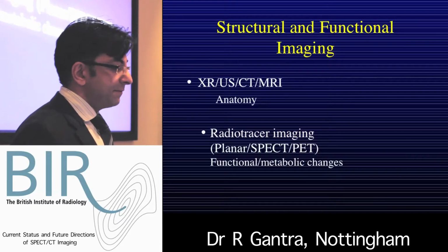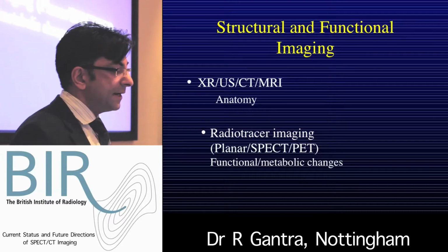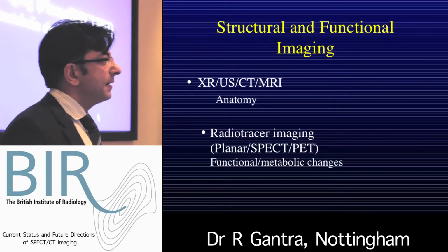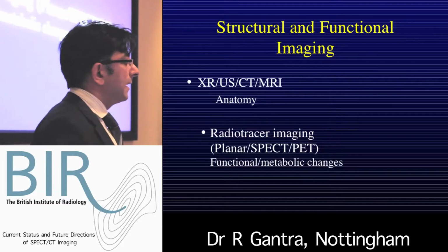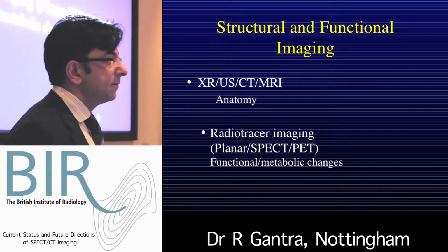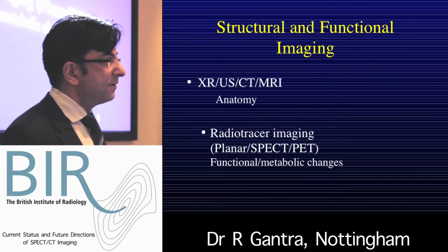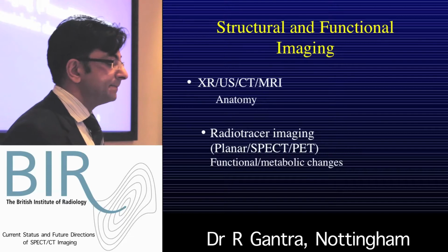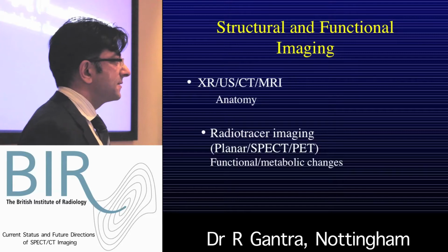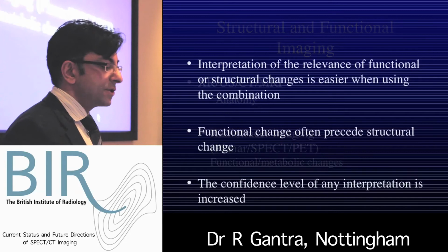We've had functional and structural imaging for quite some time. X-rays now have been around for over 100 years, and they're great for anatomy. And the recent development of functional MRI and contrast ultrasound, for instance, has started to give us a little bit of functionality. But I think everybody would agree, including most radiologists, that nothing beats radiotracer imaging functionality. And more recently, the introduction of SPECT techniques and PET techniques has meant that we can localize that functional change much more accurately.